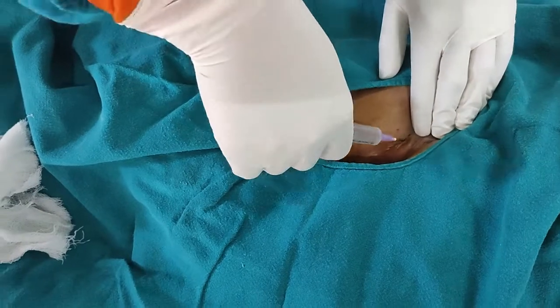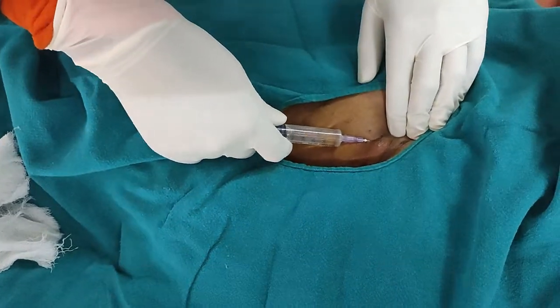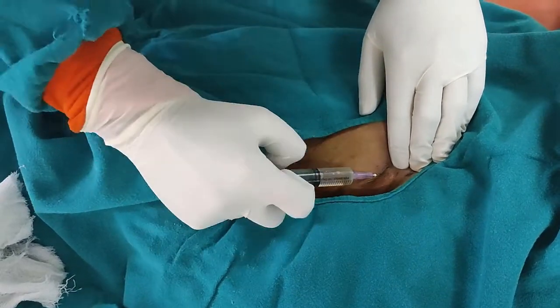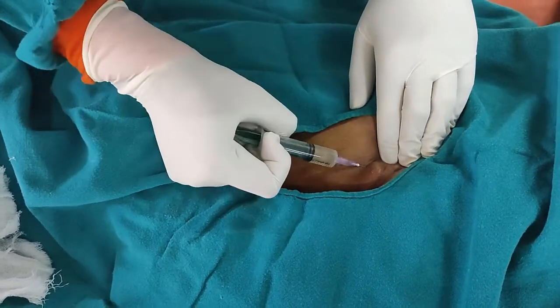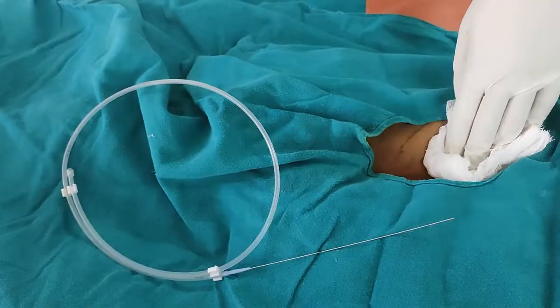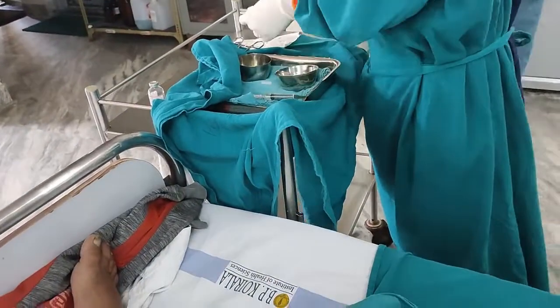Now I am going to inject lignocaine local anesthetic to anesthetize the soft tissue, because insertion of the femoral catheter can be a painful procedure. This is the guide wire.